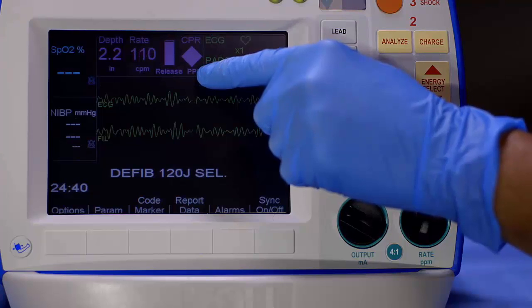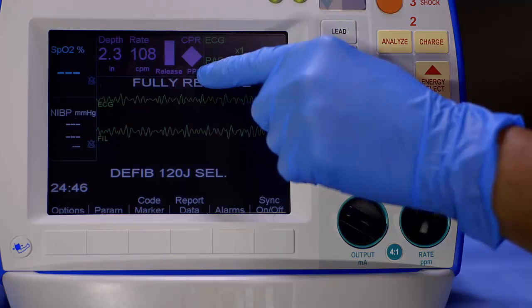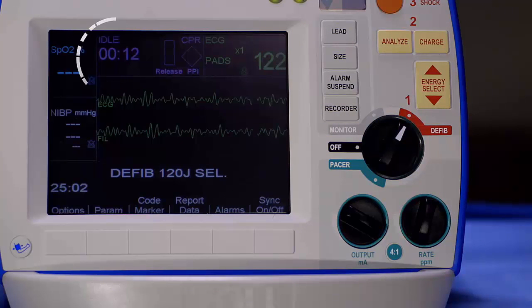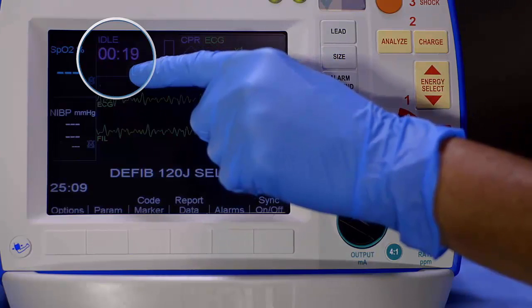The perfusion performance indicator integrates compression depth, rate, and interruption times into one visual indicator. Maintaining maximum value with a full indicator provides visual indication of performance to the current guidelines. When compressions have been interrupted for an extended period of time, idle time is displayed in minutes and seconds. This is a visual reminder to help minimize pause time.